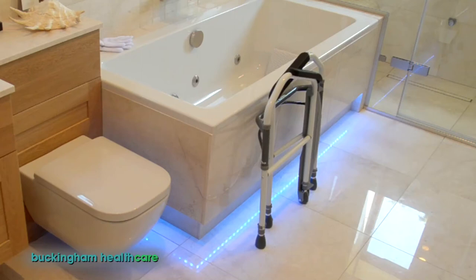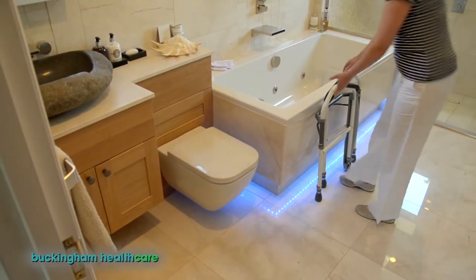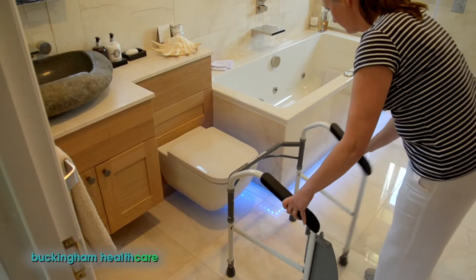This is the FoldEasy toilet frame designed by occupational therapist Chris Buckingham. Place the frame in front of your toilet and open each leg until the spring clips lock safely into place.